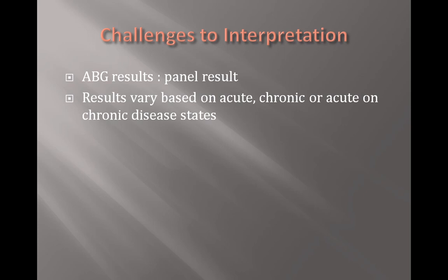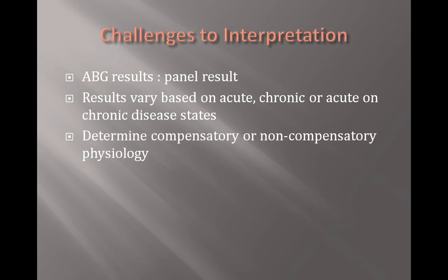So with this in mind, be sure you have a good understanding of your patient's underlying disease process as you evaluate your ABG results. One of the first questions you'll want to ask yourself when evaluating results would be, does the patient, or does our treatment for the patient, demonstrate an ability to compensate for their acute, chronic, or acute on-chronic condition? This is an important consideration, as the compensatory mechanisms can often go a long way to stabilizing a critically ill patient. We'll come back to this in a little bit more detail later in the tutorial. This knowledge will help to then consider the most appropriate treatment options for your patient.